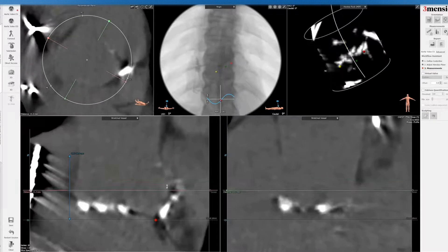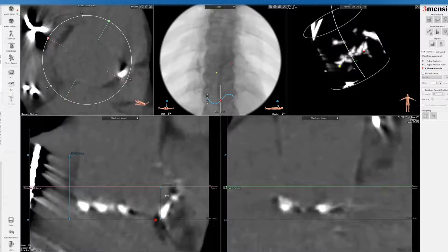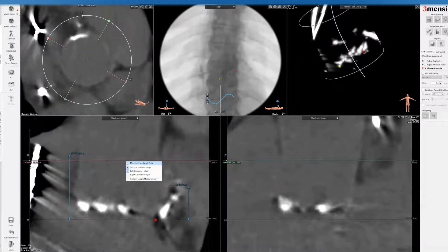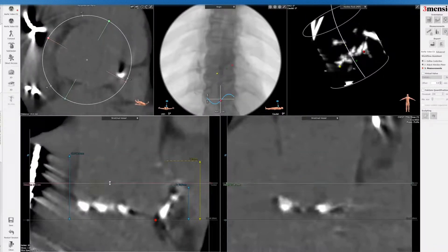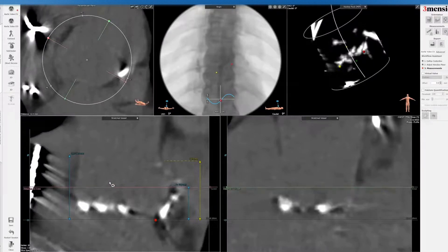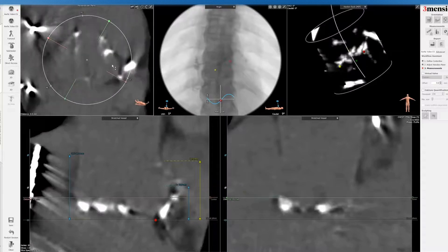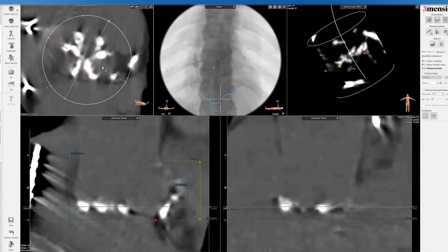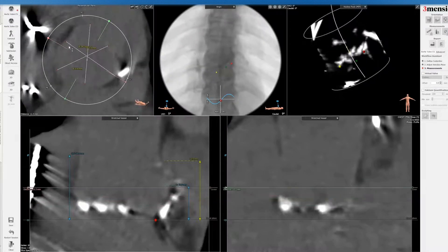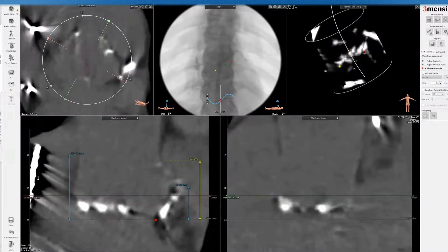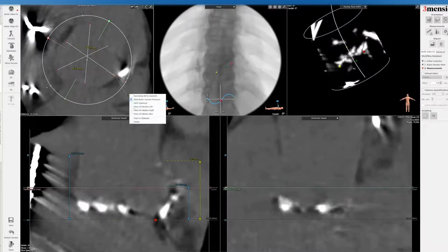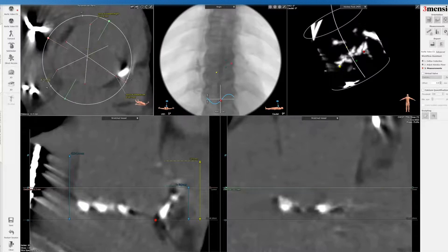Come down here — you can see the left main coming out; it looks like it bifurcates early. You can right-click and go to left coronary height — this is the left sinus height. You can then split the sinus height in half to look at the sinus of Valsalva. This is harder to tell because you don't have the leaflet or commissural distance as a landmark, but you can still roughly estimate that. You can also go down to see where the sinus commissures are in between. This looks actually pretty reasonable — left sinus, right sinus, and non-coronary sinus.